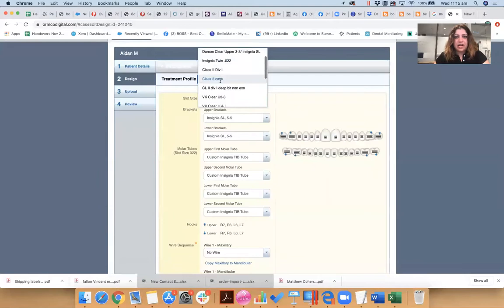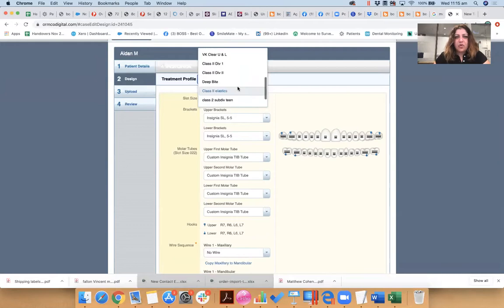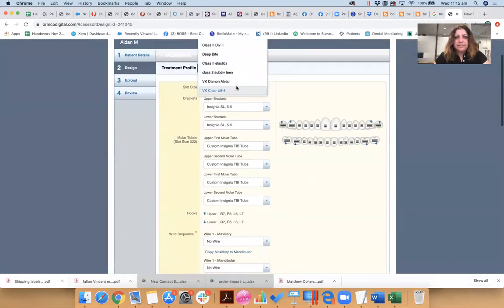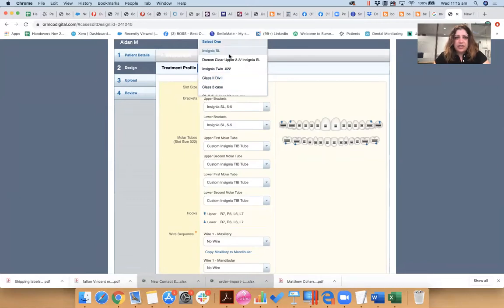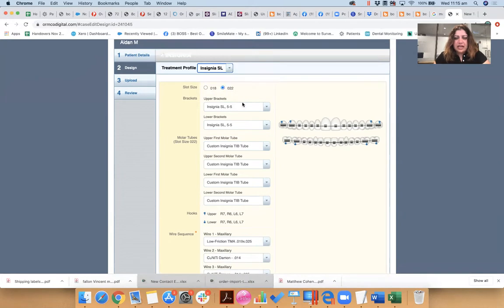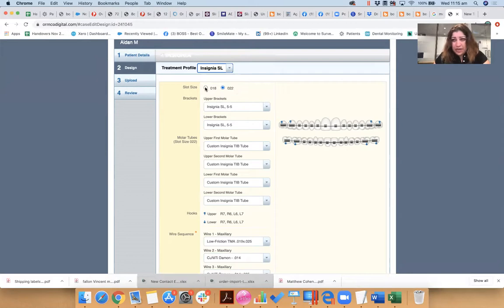I've got a few saved up for Class II Division 1 cases, for Class III type of cases, non-extraction deep bite cases. I've got quite a few different ones saved up. But what I do want to do for this case, I'm going to be doing my Insignia self-ligating brackets. I'm just going to start from scratch.